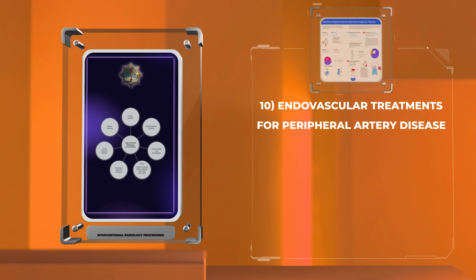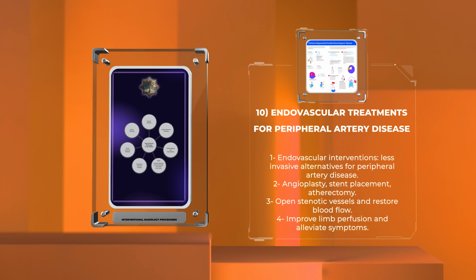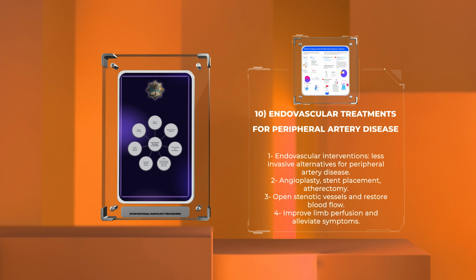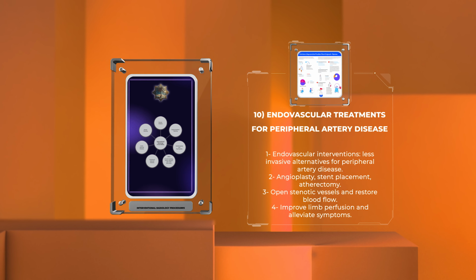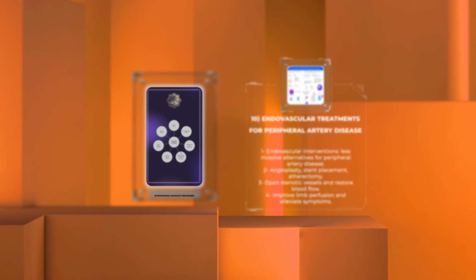Endovascular interventions offer less invasive alternatives for the management of peripheral artery disease, PAD. Techniques such as angioplasty, stent placement, or atherectomy are employed to open stenotic vessels and restore blood flow, improving limb perfusion and alleviating symptoms. These interventions enable patients to avoid major surgeries such as bypass grafts.